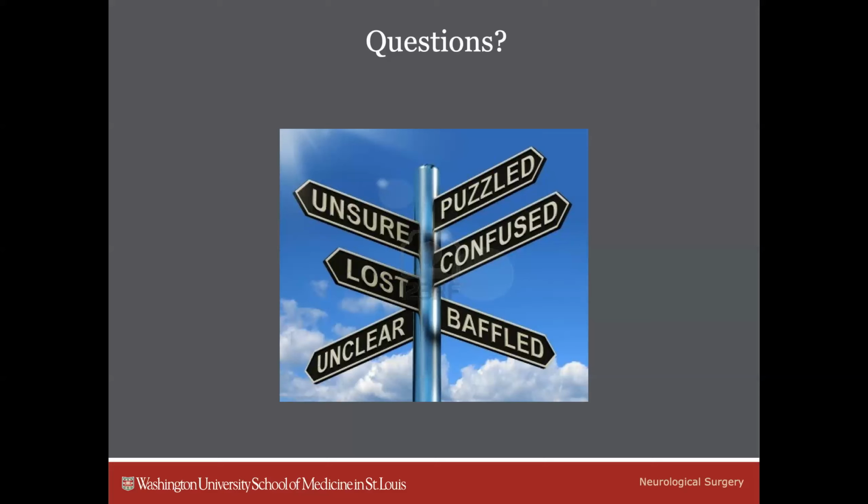There was a randomized controlled trial that was done and published in NEJM in 2012. This was done in South America, in a low resource setting, and looked at one strategy of just clinical management using neurological exam and CT scan findings versus using an ICP monitor. The study conclusion was that ICP monitoring didn't really change outcomes. But one of the caveats is that this was done in countries where patients don't have access to good quality healthcare like we do in the US.